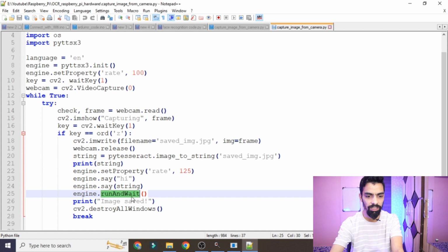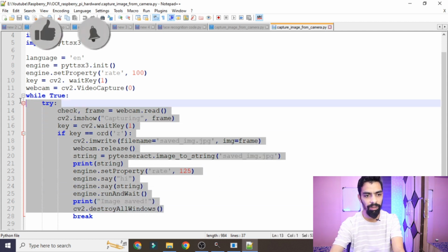Then after that line is completed, that say is completed, we have to stop the engine, then print on the screen image saved, and destroy whatever image windows are on the screen. So this is the basic idea behind this code.